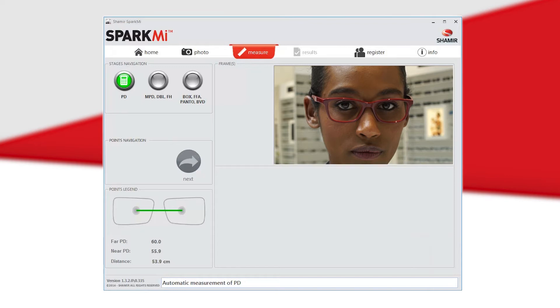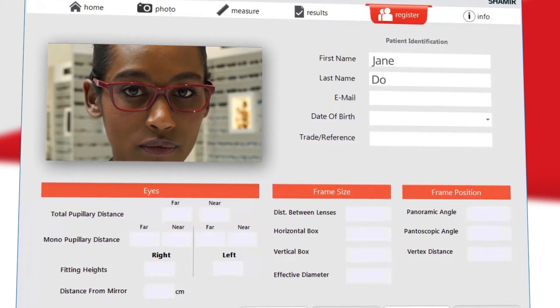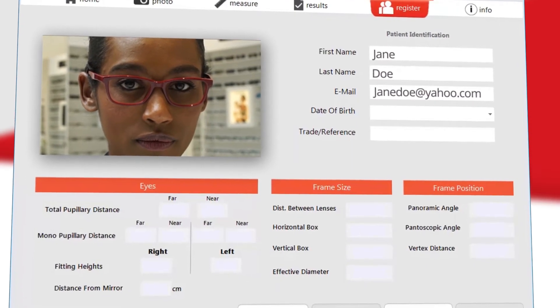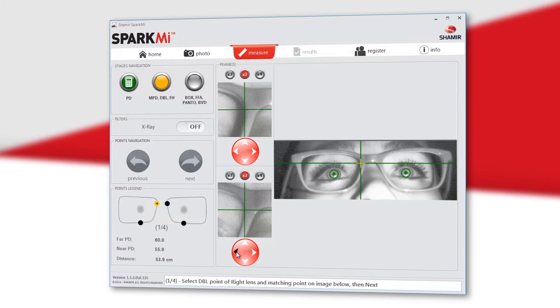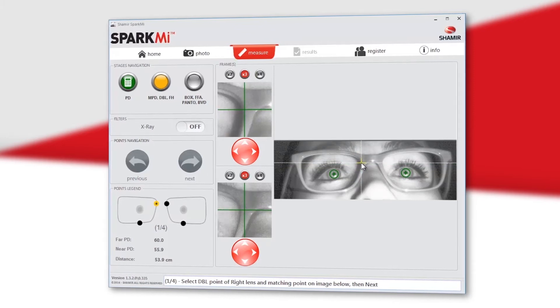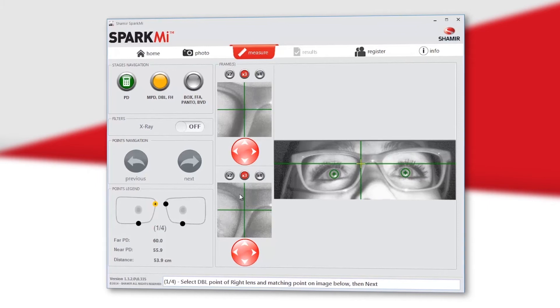Once the picture has been successfully taken, the far and near PD will automatically appear on the bottom left side of your screen. You may proceed to the measurement screen or save the photo and complete the patient's measurements later by hitting the Register tab and filling in the patient's information. On the measurement screen, you will find the patient's image where you will mark eight points. Use the arrows of both small images to locate the cursor at the required place. It is imperative to mark all points on both the upper and lower images.